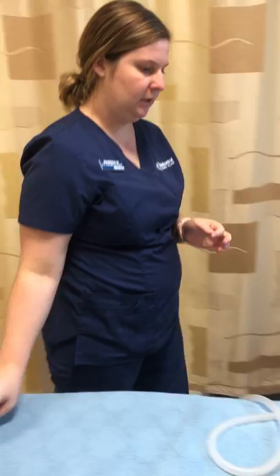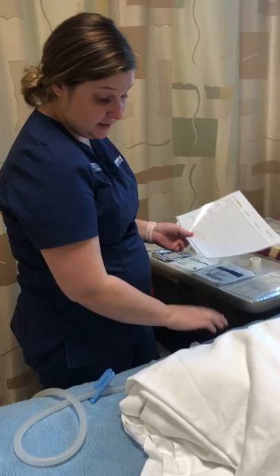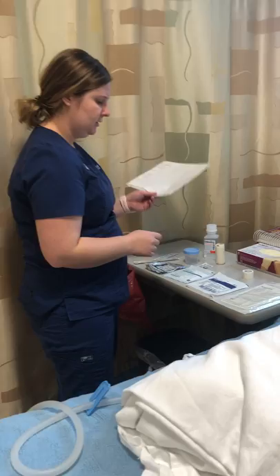Then I'm going to knock, knock, knock, and provide some privacy. I'm going to say, hi Jennifer, my name is Marissa, and I'm going to be doing your chest tube dressing change today. Can you please tell me your name and date of birth? Checking her armband, she would say, Jennifer Doe, 11-5-1975, and I would check that. Everything matches and looks good.